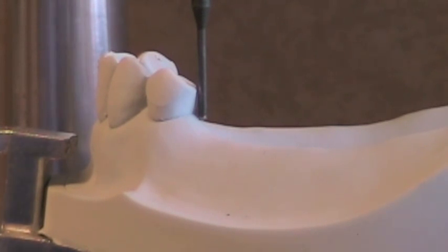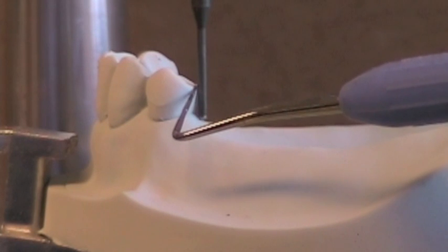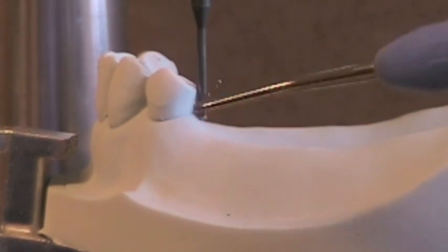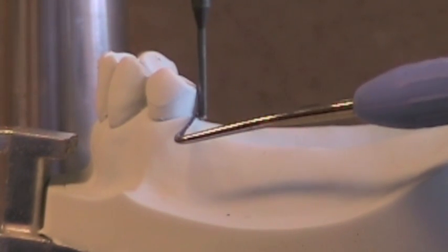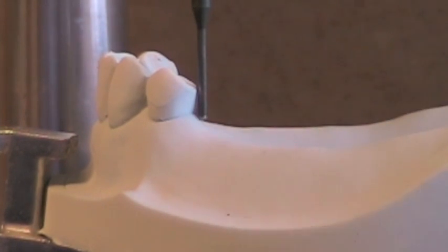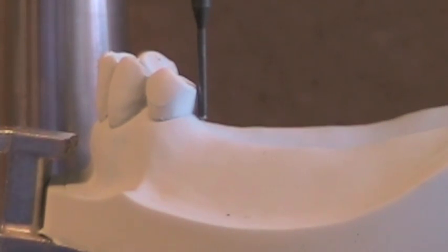What you would be looking for is to see where the height of contour is, where the analyzing rod is touching the tooth, and also how much space is in between the analyzing rod and the tooth at the level of the free gingival margin.